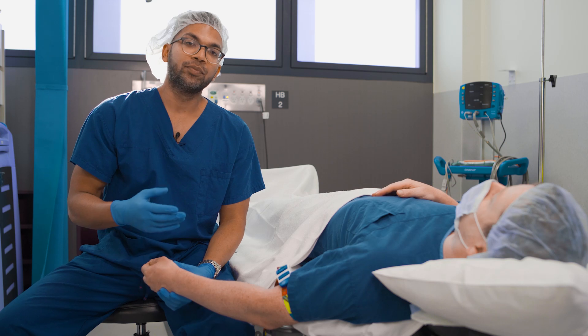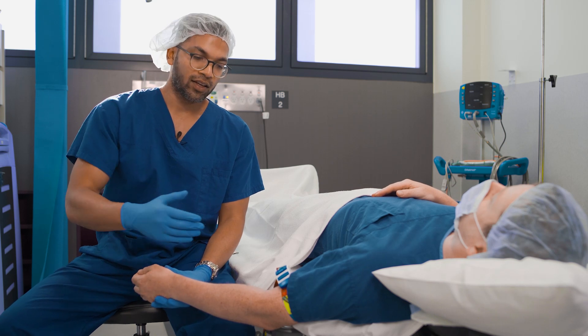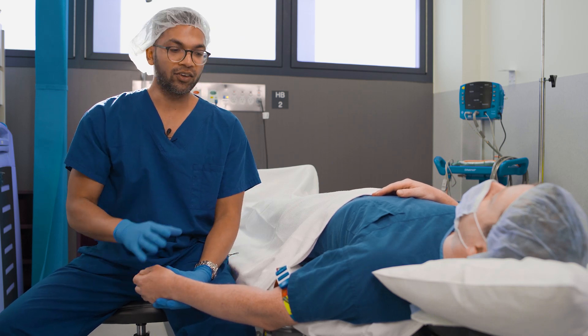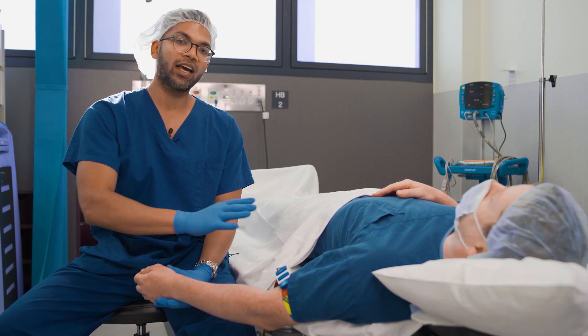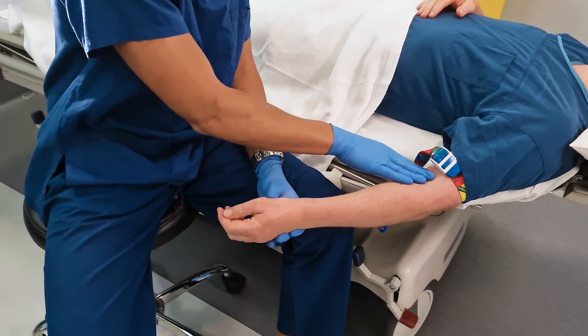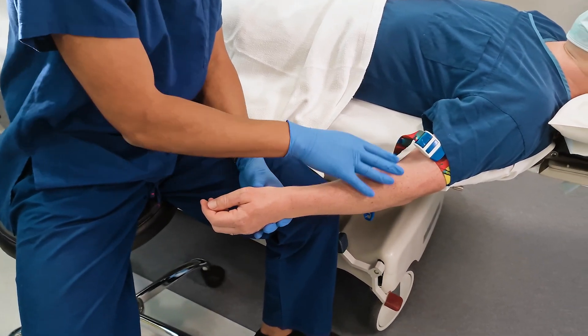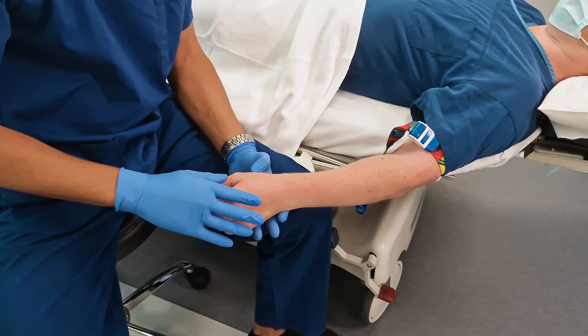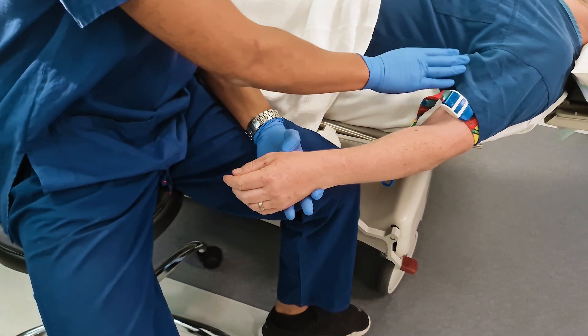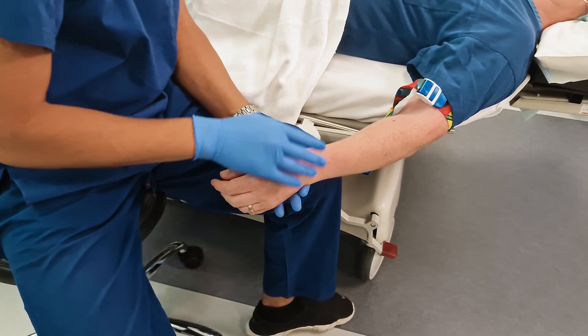There are broadly speaking three main areas you can cannulate on the arm, not counting other parts of the body. These areas are the antecubital fossa, the forearm, and the hand — and occasionally I'll also look at the upper arm as well.